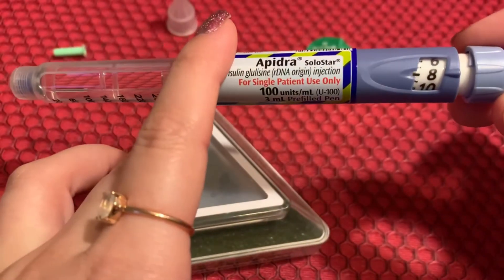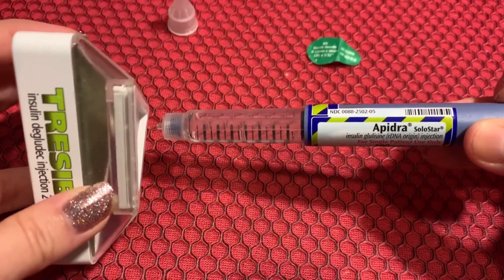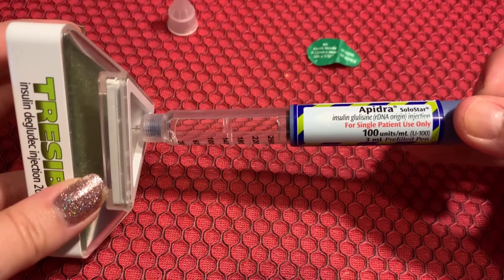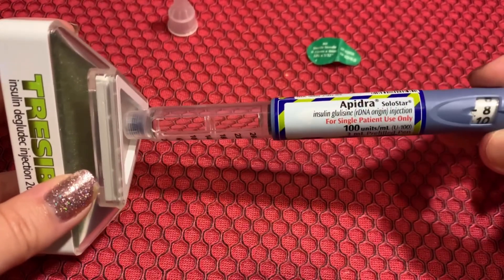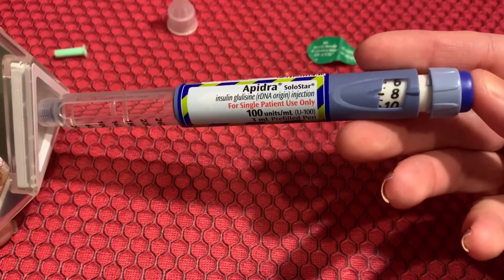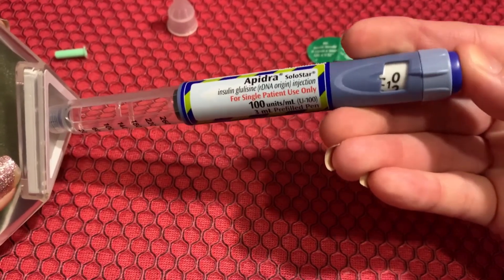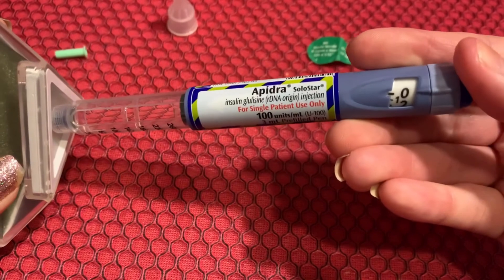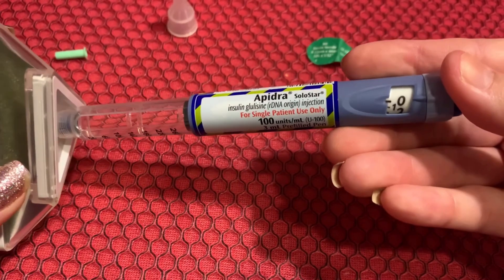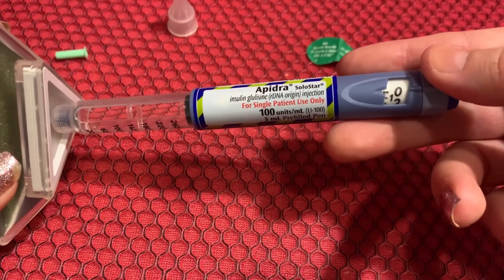We've dosed up eight units and picked our site. You can pinch up your skin — if you have enough fat though, it's not necessary. Try not to pinch up too much. Go in at a 90-degree angle, and then if you've been pinching, let go of your skin so that you don't push any insulin out. When you're ready to inject, press down on the plunger — it'll make some satisfying clicking noise. Once you've hit zero and can't push anymore, just give it a little tap to make sure you get all of it. Then wait ten seconds so the insulin doesn't leak out of your skin after you pull the pen out.